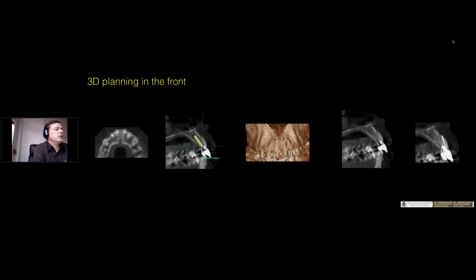This case is 6 years old. This is a young girl who had an accident, and she came to the dentist. She had 4 root canal treatments. All the treatments failed. You can see the big infections, the loss of the bone, and also the angle of the teeth.